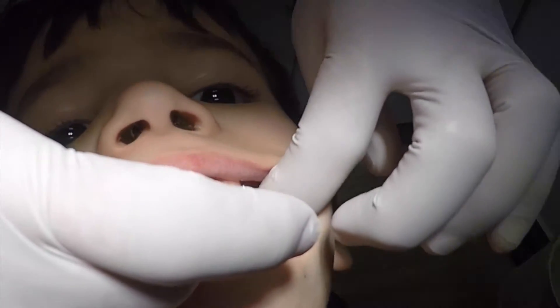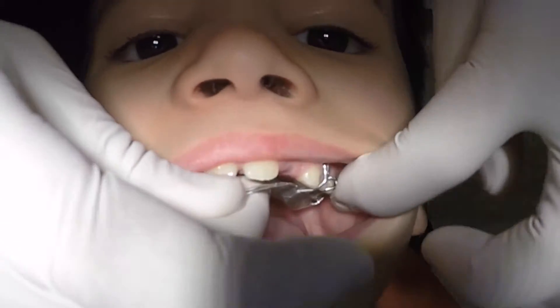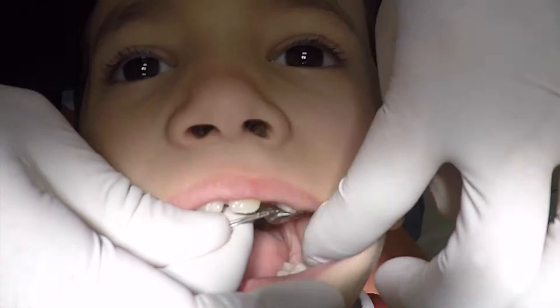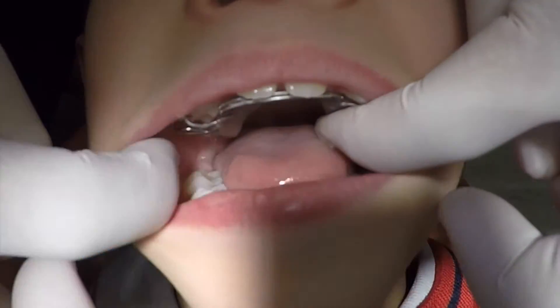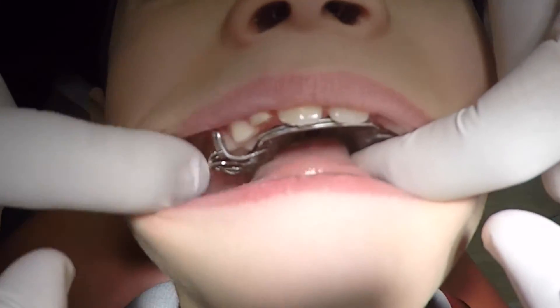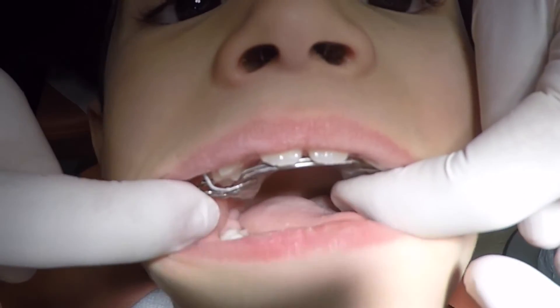We put the two prongs between the papilla and the contact points. We don't have to look, we just have to feel the ear. When that's in place, we use this index finger to press on the plastic and it will fold into place. We check to make sure that the clasp is sitting over the ear.